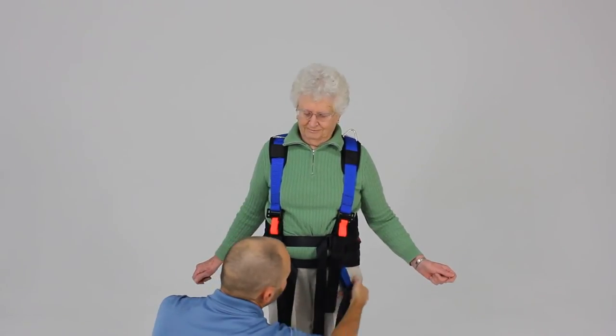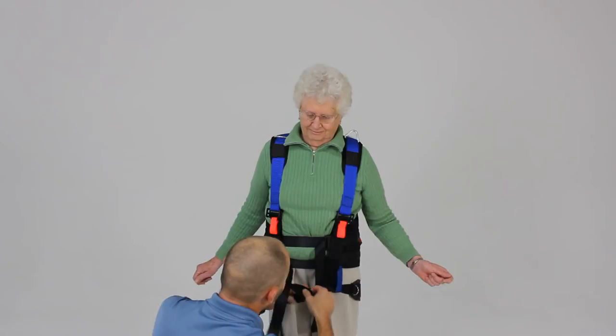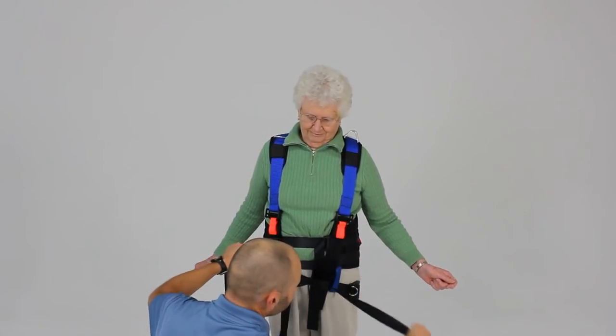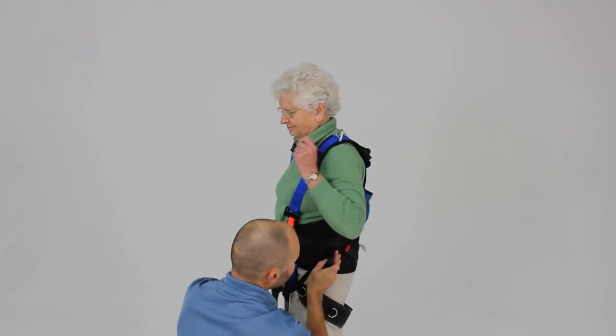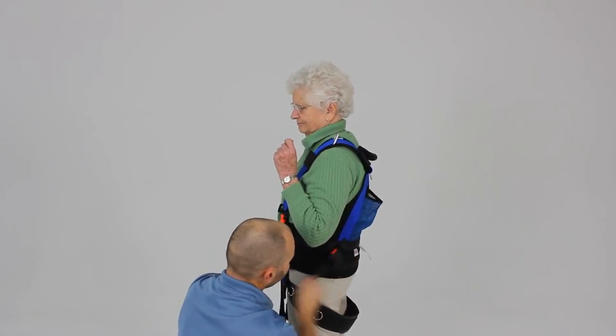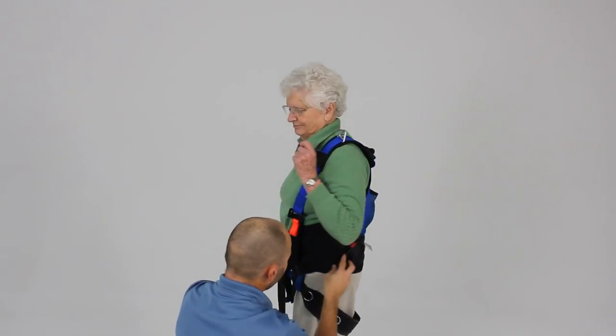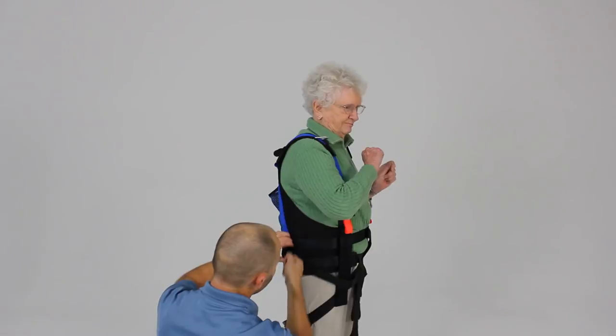Let's tighten that up and get an even position. Then we're going to take these straps and they're going to actually crisscross in front of the patient and go to the angled buckle here on the back side of the harness. We're going to clip that in, then clip this into the angled buckle on the other side and take up our slack.